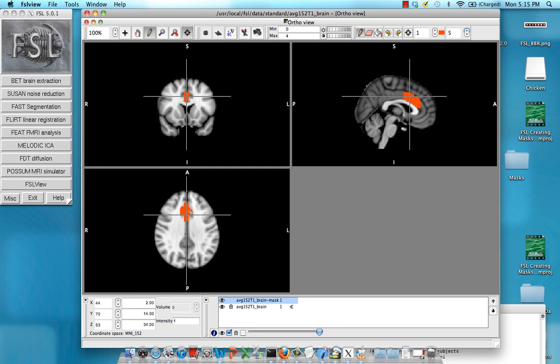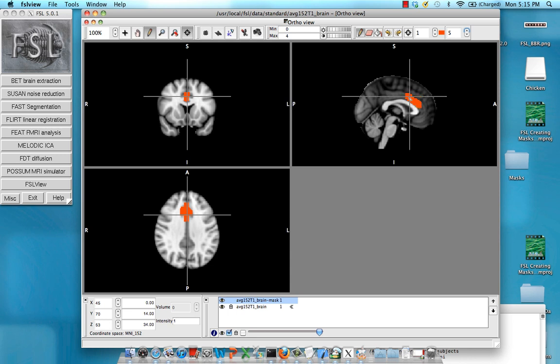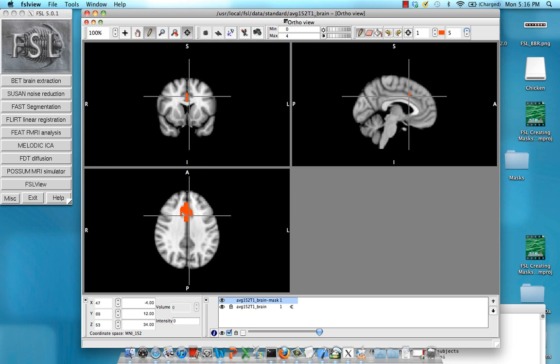For example, on the transverse slice, I'm going to the left or the right. You can see that I need to fill in this slice now with more voxels. Do that until you have a good 3D representation of the region that you want to create as a mask.